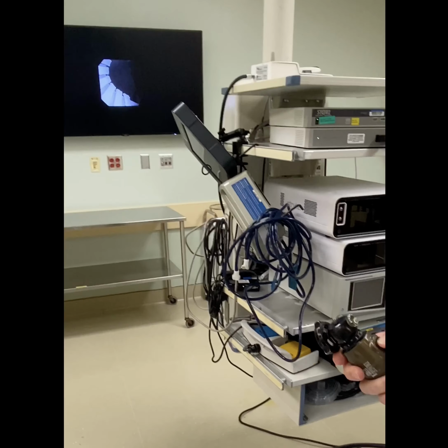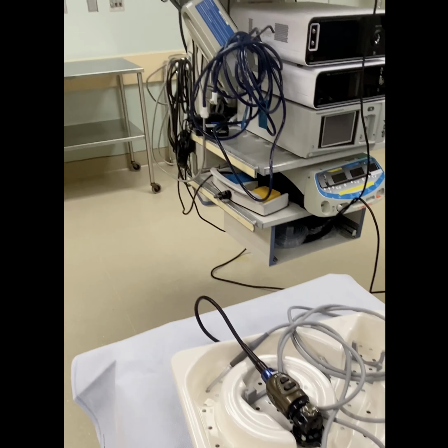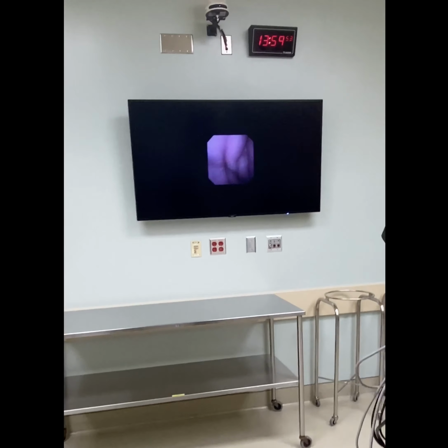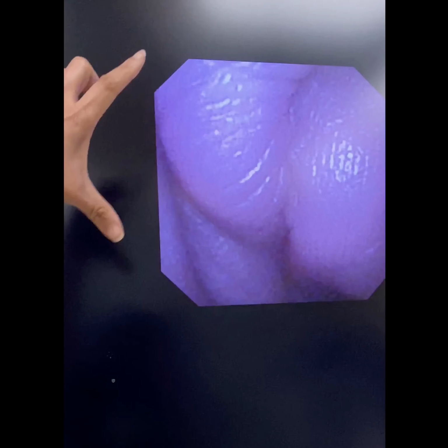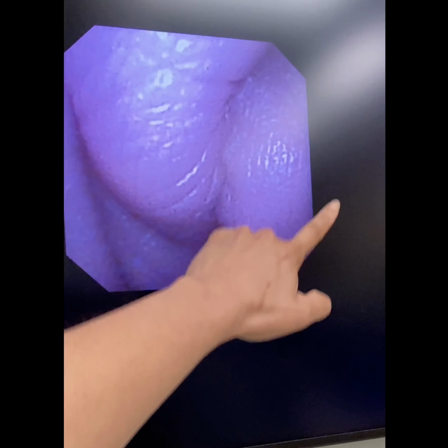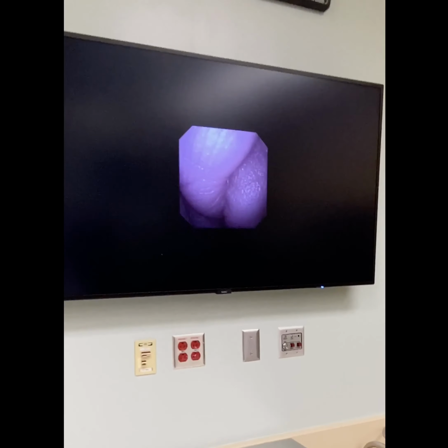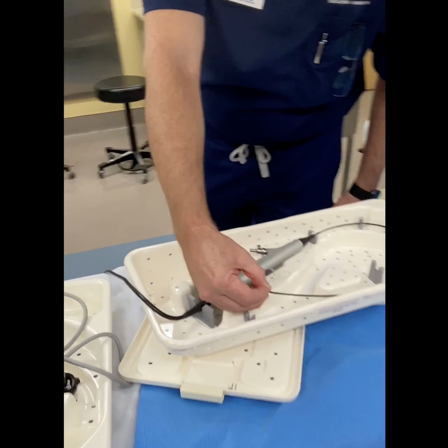Okay, there we go. So now we changed the image from the regular cystoscope, or the regular downward camera, to the digital ureteroscope view. The way you can tell is that the image has gotten a little smaller, and as you can see, it looks like a square image. That's what you're looking for to tell that you're actually using the digital ureteroscope.